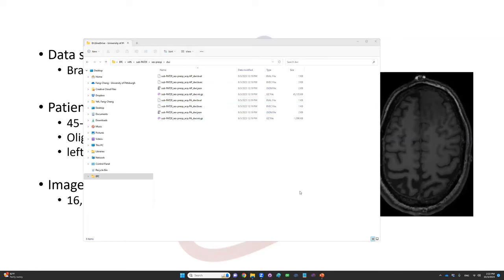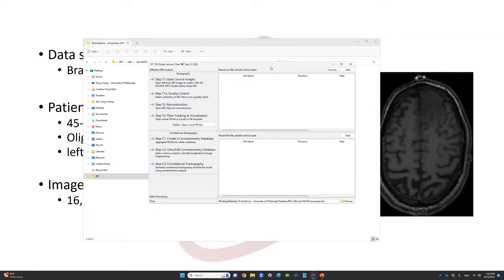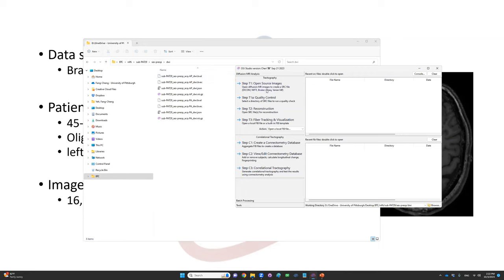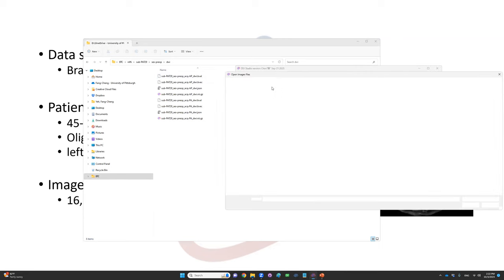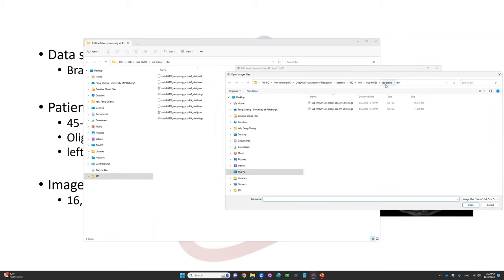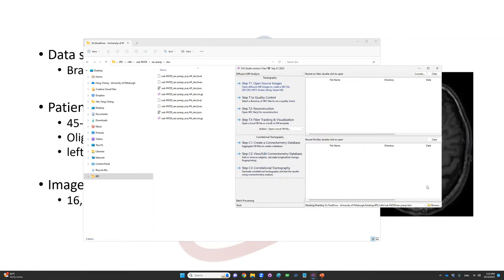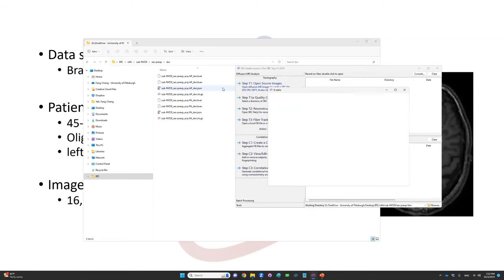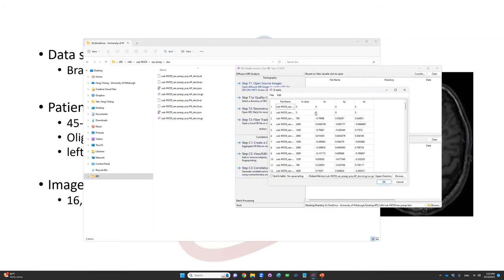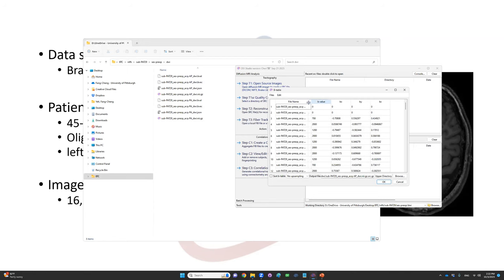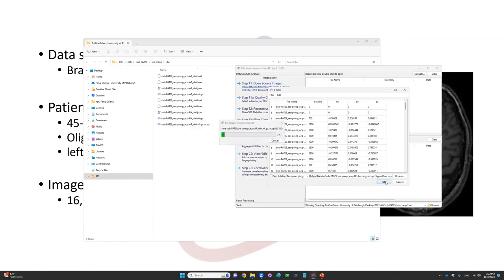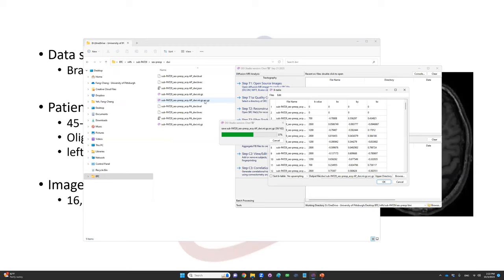Start DSI Studio. To process this data, click on the first button, open source image, and click on the AP underscore DWI.nii. DSI Studio will read the bval, bvec, and match the DWI data. Click OK. DSI Studio will aggregate these three files into one file with SRC.gz extension. From this data, we will proceed with reconstruction.